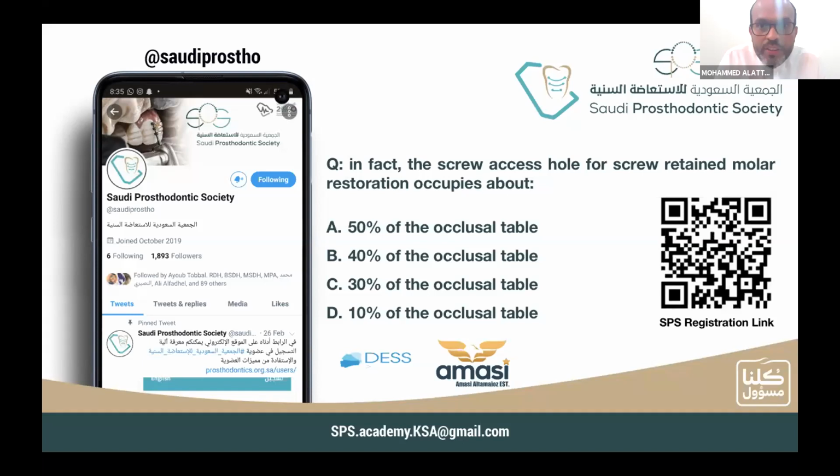We have an accurate impression since we don't need a verification check. As I said, if you do a screw-retained prosthesis and have any misfit, you can do some adjustment and get a good fit.